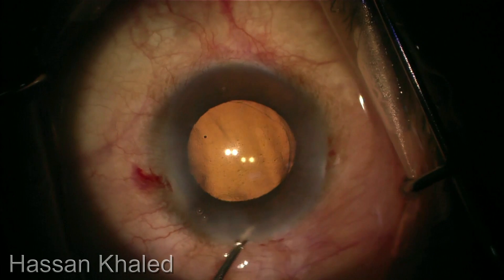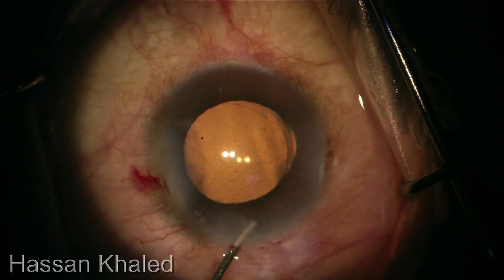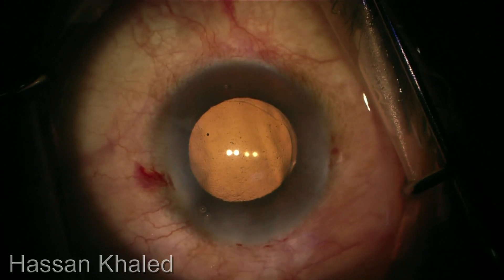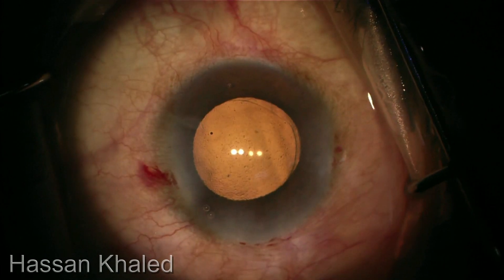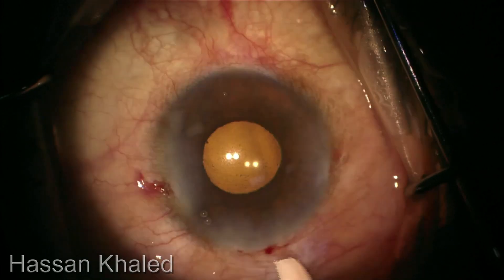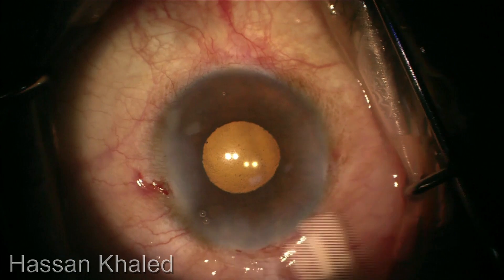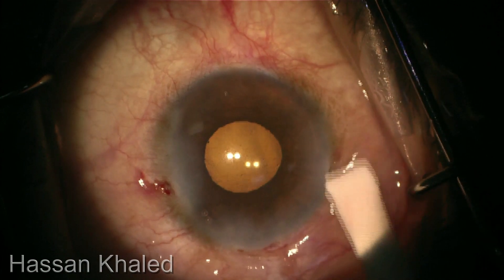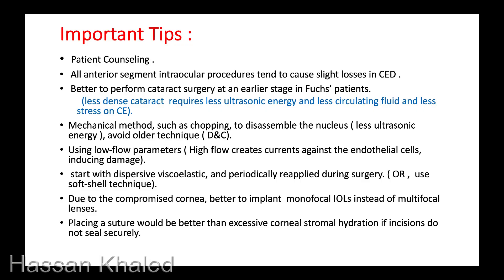Now at the end of the surgery, injecting miochol and intracameral antibiotic. No leak.